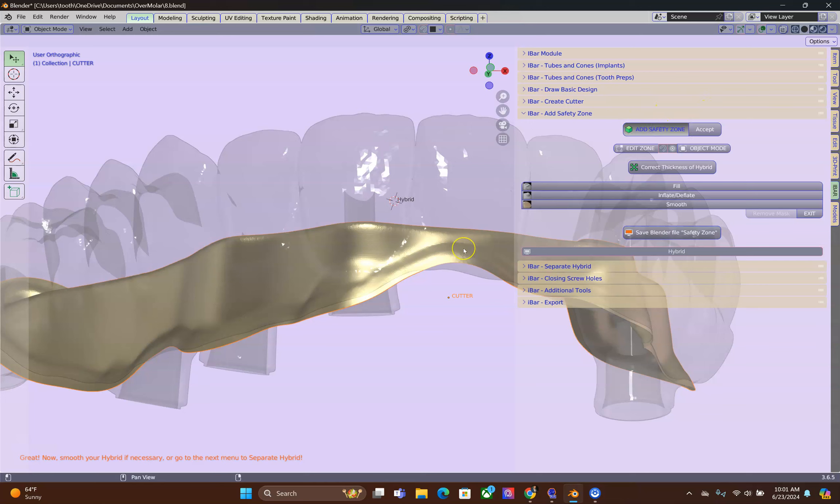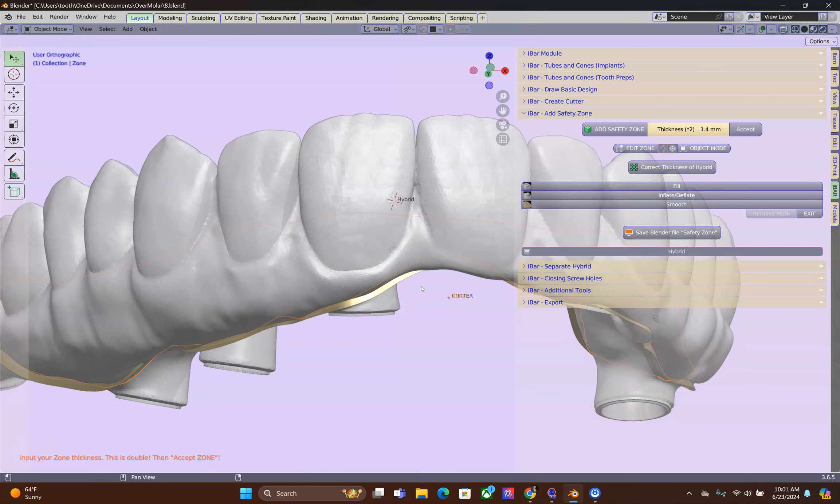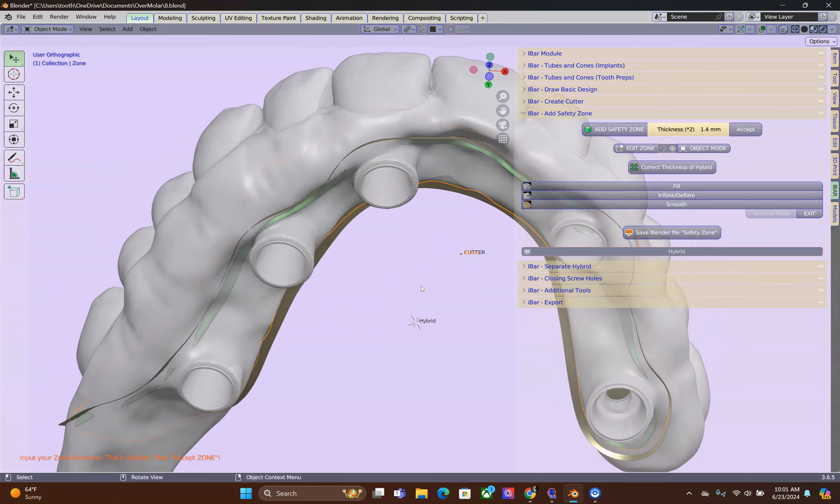Add Safety Zone. You will note that some of the Safety Zone will appear underneath the hybrid. Especially if you have concave areas. If they are convex, it shouldn't appear.